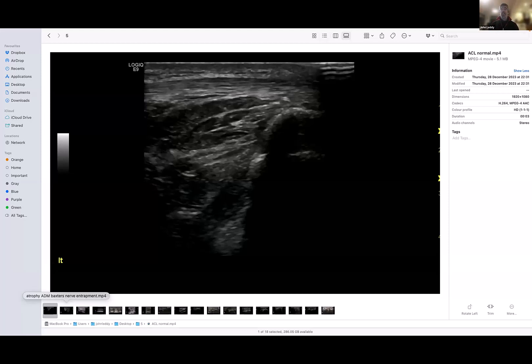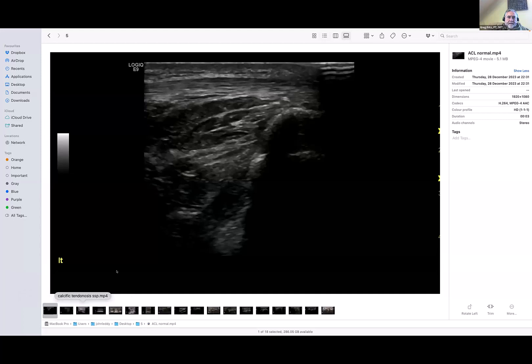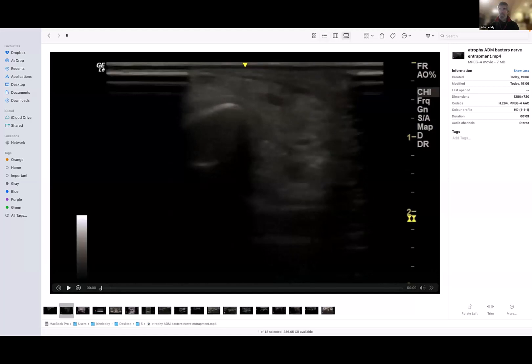It doesn't really have much diagnostic value, but when you see it and it's nice, and if you're going to be looking around there anyway, I just look for it. You see a lot of cysts and a lot of other things, which can be relevant — not always — but it's just part of looking.